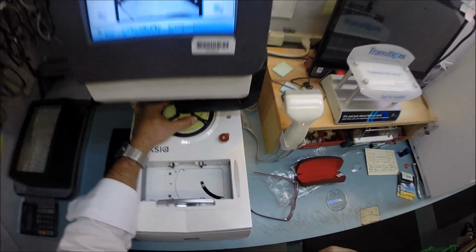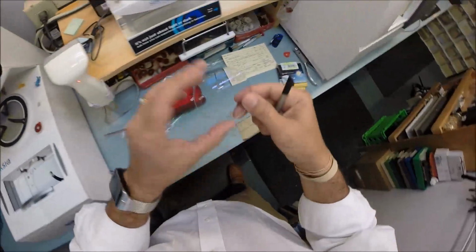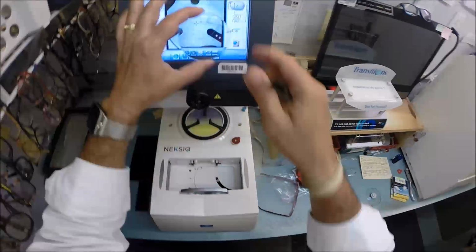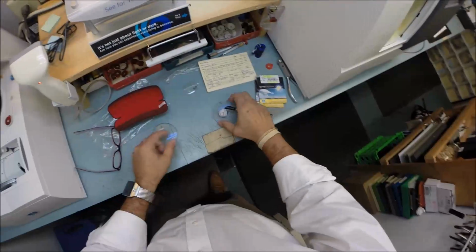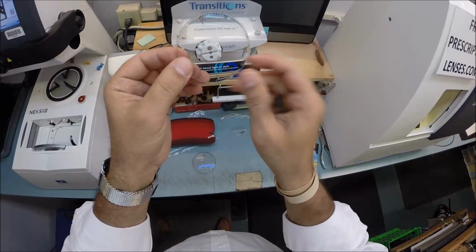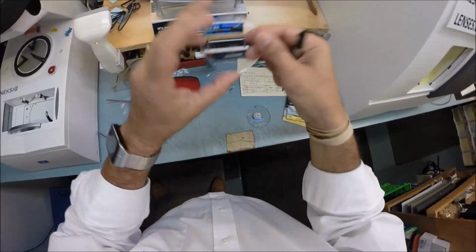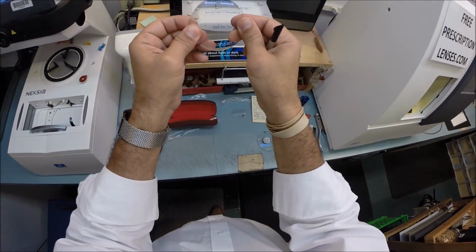The arm comes down, places the block onto the right lens. Now the cool thing, the reason why I put these dots on there, it has to be oriented just perfectly. Because your lens is spherical, I literally could have rotated any direction, and as long as I had the pupillary distance right, it would turn out fine. This, I can't do that. It has to go in there just like this, or like this.